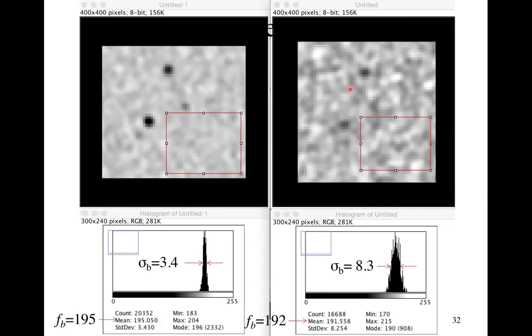In the image that we obtained with far fewer photons, and which had poorer signal to noise, when we look at the root mean square deviation of the same background, we get a bigger number. The pixel values are varying around the mean more. We get basically the same mean, because it's the plastic, so it has the same value. Obviously, if you get more and more pixels, the two means will approach each other, because it's the actual mean.